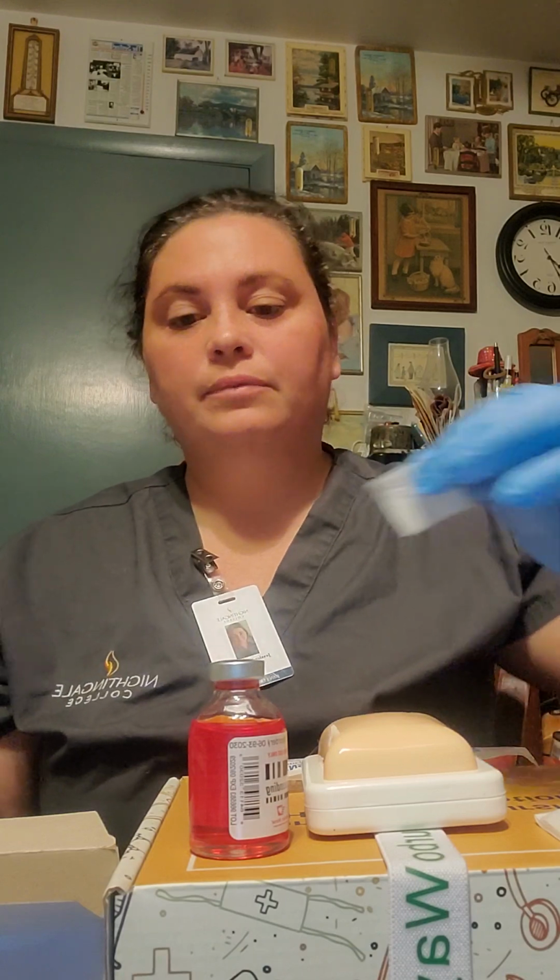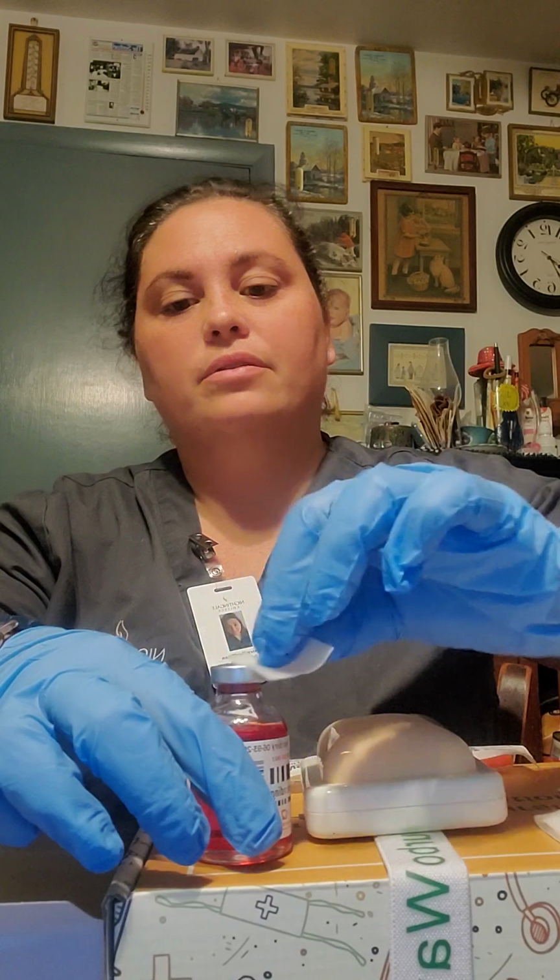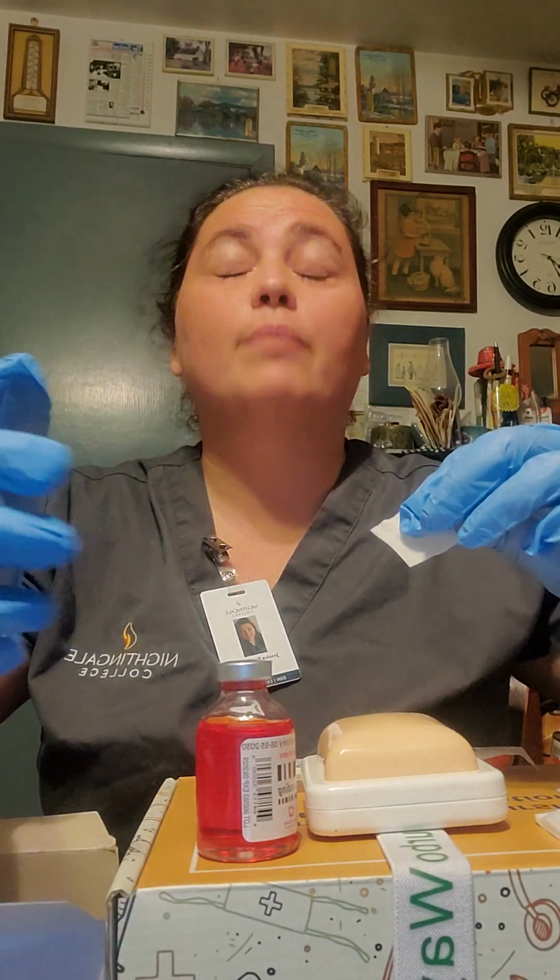Okay, so first of all, I am going to get my alcohol swab here. I'm going to take that out. I'm going to clean my vial after popping the top. Mine has already been popped off due to practice. Alright, I would throw my alcohol swab into the trash. I then would get my syringe. While that is drying, I'm going to open my syringe here.